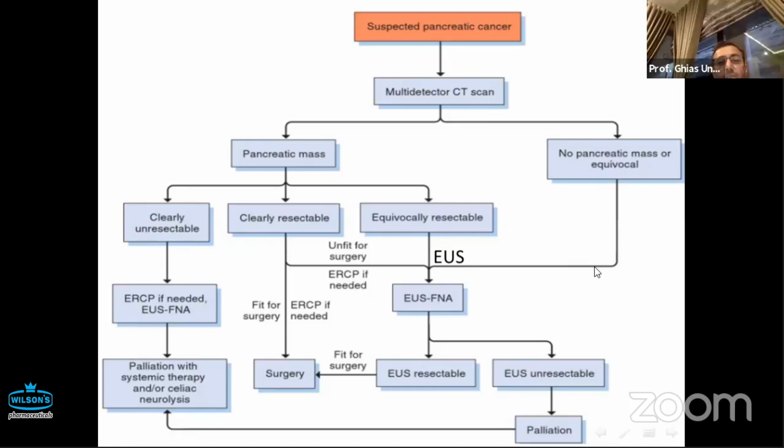Professor Hussein, what's your experience in T1, T1A, T1B tumors with RFA? Do you do the RFA for these tumors smaller than 1 centimeter? Yes, yes. We did till now 7 cases of EUS guided radiofrequency ablation by EUSRA of Taiwan. But for small adenocarcinoma, we did only 2 cases, and this is not the standard of care. The standard of care is surgery.